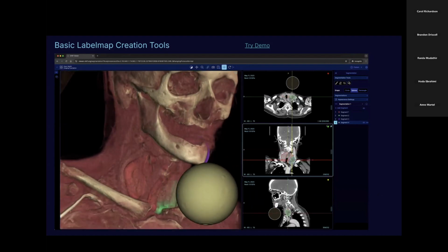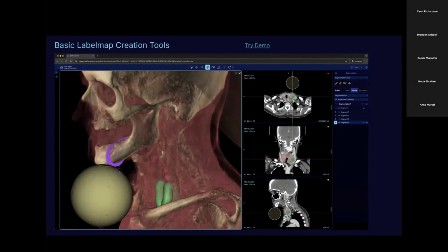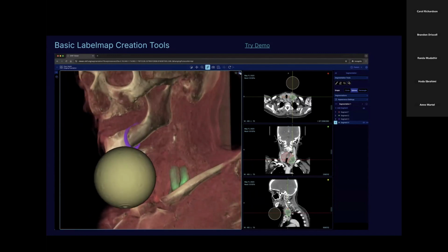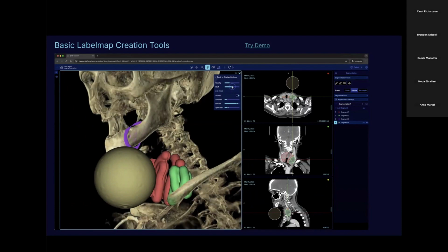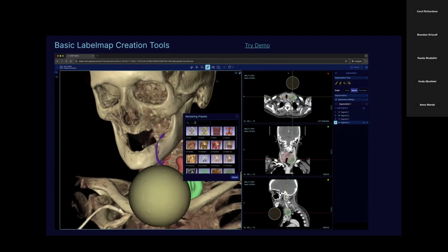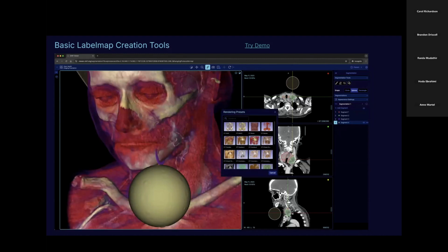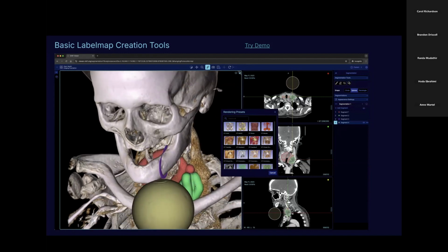So we convert label maps into meshes and polygons using our WebAssembly converters and run it in a web worker, so that we make sure the UI remains responsive. As I said, this is a web browser environment, not a full-fledged desktop environment. So there are limitations in terms of JavaScript being single-threaded. You can't compute a heavy task on a single thread. You need to offload it.